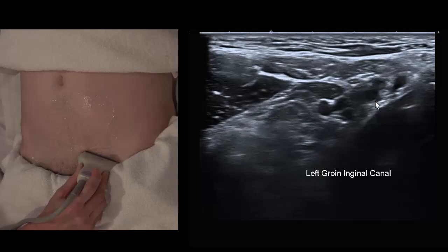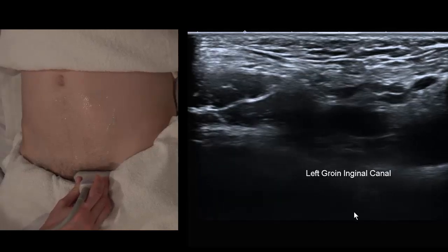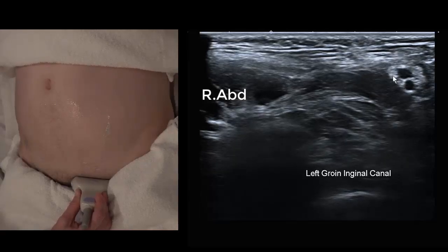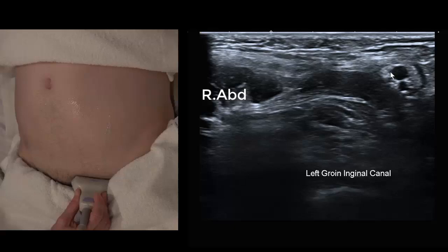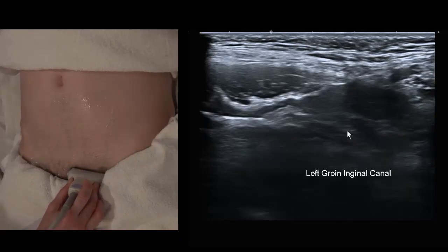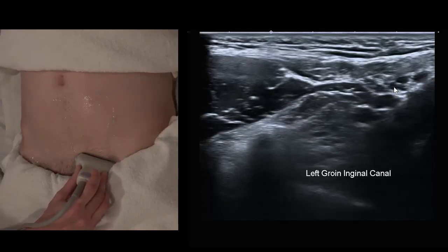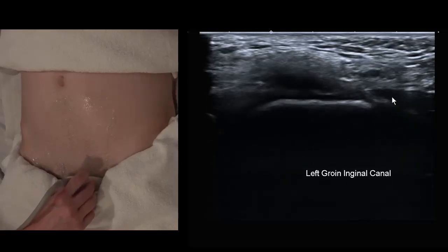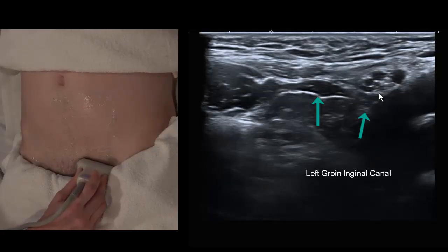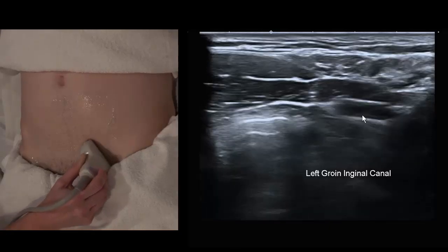What we've done is trace the spermatic cord from its external ring back up to the deep ring, then sit down at the superficial ring looking for anything bulging up through the region of Hesselbach's triangle. Rectus abdominis is to the left, spermatic cord to the right. Even though the spermatic cord gets displaced and you can see a bulge, this is completely normal — there's no direct hernia. Running from inferior to superior, looking at this layer and looking for a defect, we've arrived at the deep ring without seeing a defect medial, so we know there's no direct hernia.